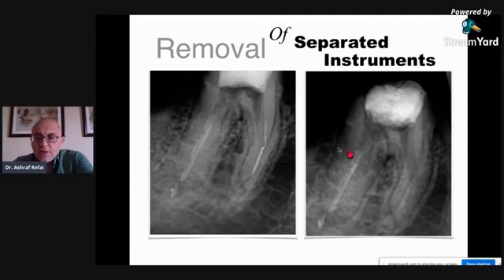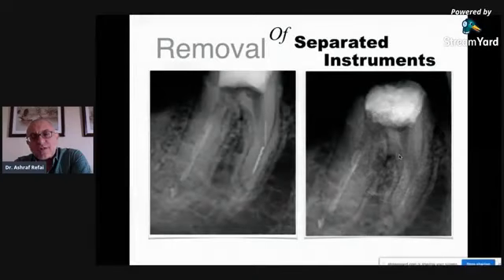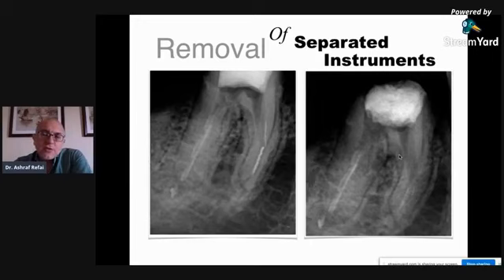But even though this happened, you can see that even after my retrieval attempt, the amount of damage to the root canal walls is substantial. And this brings me back to the point I mentioned at the beginning of my lecture, that bypass is still preferred to instrument retrieval, because the amount of damage that happens inherently during instrument retrieval is quite large.